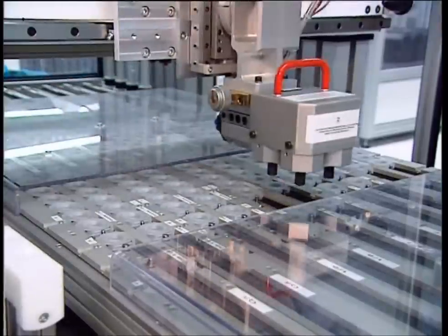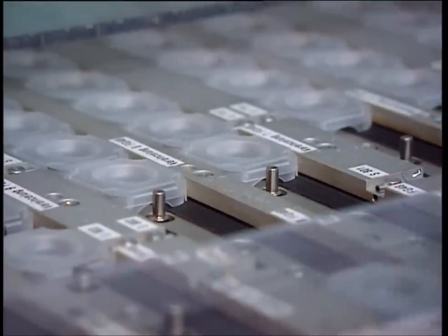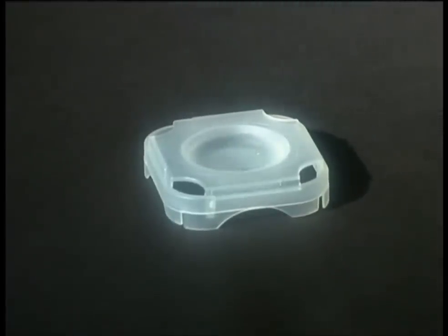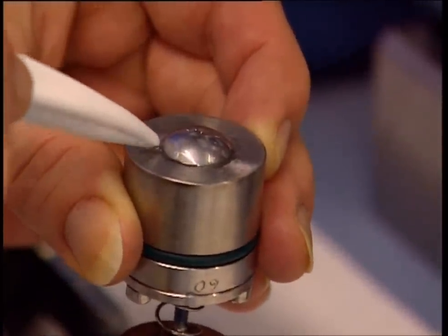At this stage the soft lenses are still rigid, so each one is placed in a saline solution where they absorb the liquid, making them soft. Once sterilized with a further blast of heat, they're ready. And for those who want their eye color to match their handbag, the soft lenses come in a variety of tints.